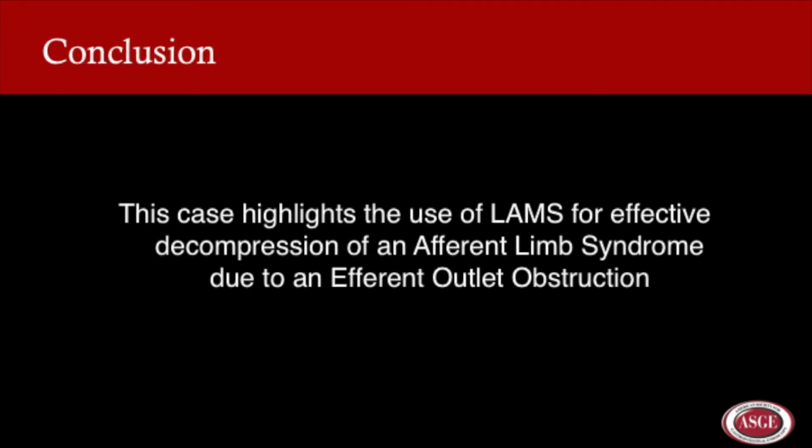In conclusion, this case highlights the use of lumen opposing metal stents for effective decompression of an afferent limb syndrome due to an efferent outlet obstruction.